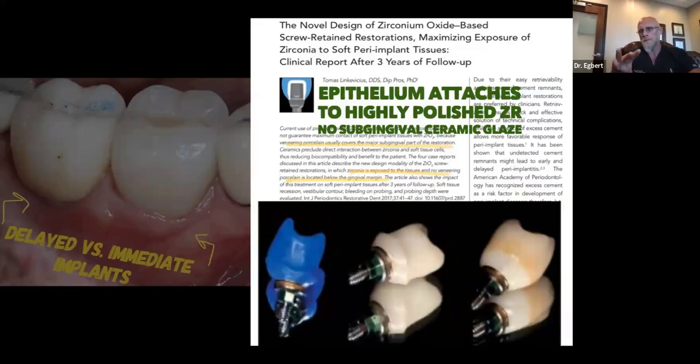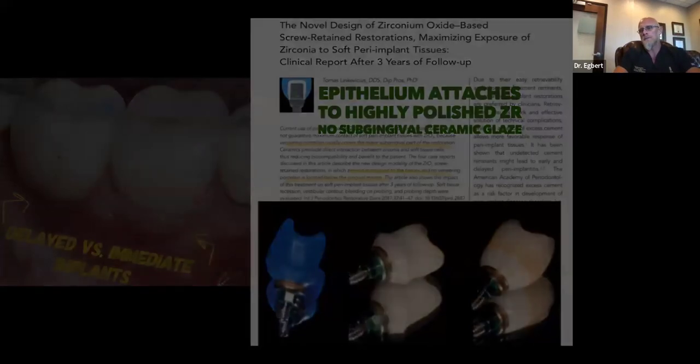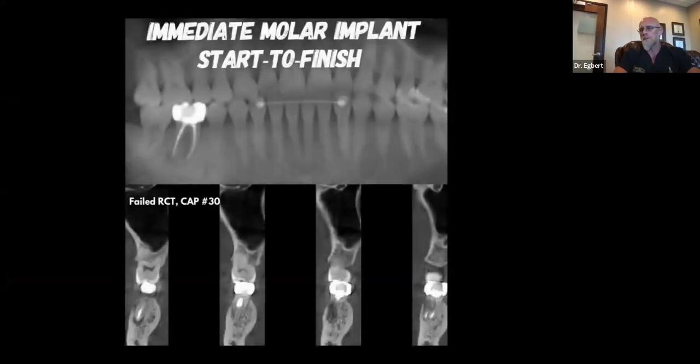To finish this literature review up, it's important to know that there are only 3 materials that tissue will truly adhere to in the form of hemidesmosomes, desmosomes, as far as epithelial attachment goes, and they are titanium, zirconia, and acrylic. So for our final restorations, we want to get as much zirconia, not glazed with ceramic, subgingivally, and that'll help fight apical migration of tissue over time and decrease the chances of food impaction, and of course, secondary to that, proximal caries.